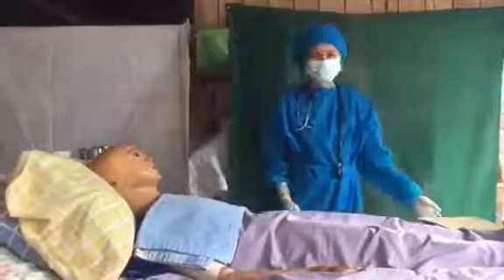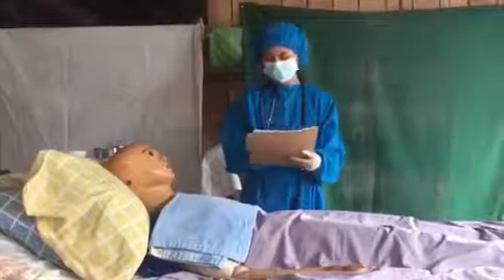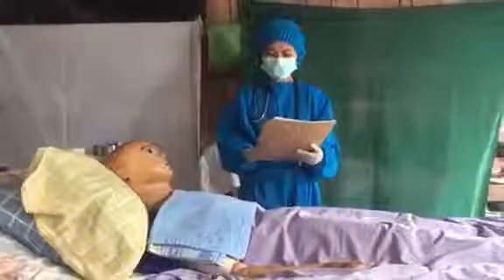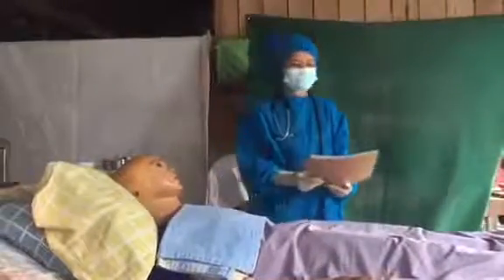So now we're going to document and record the patient's data, the reaction of the patient before and during the procedure. So clean and remove the equipments.